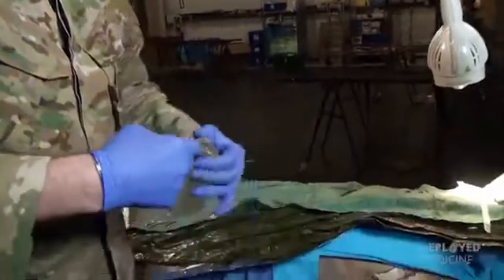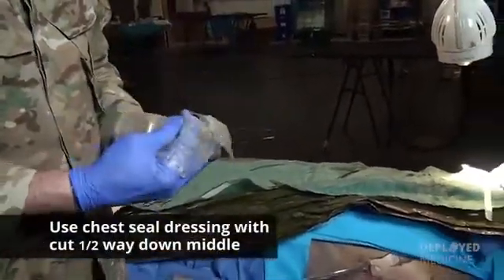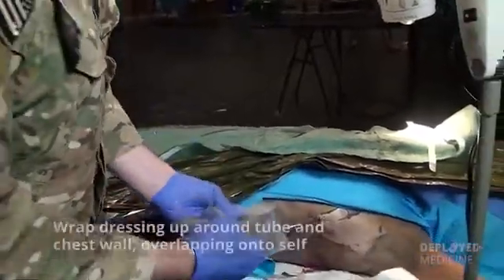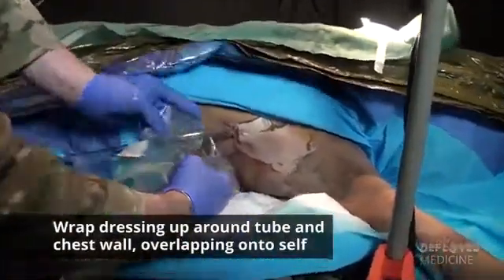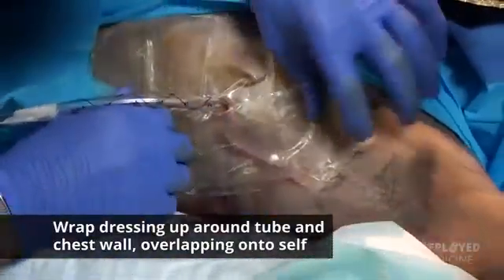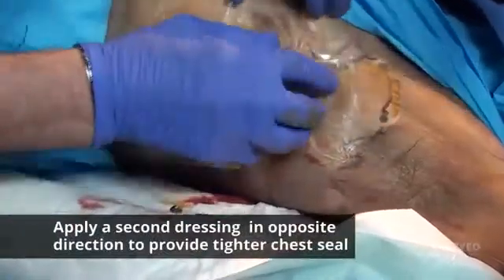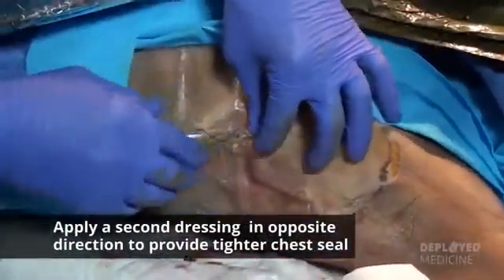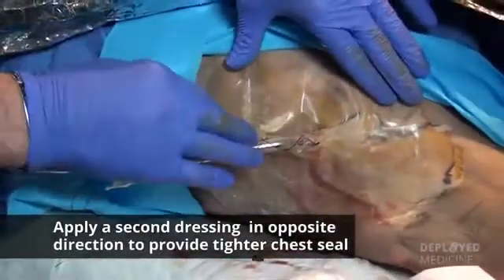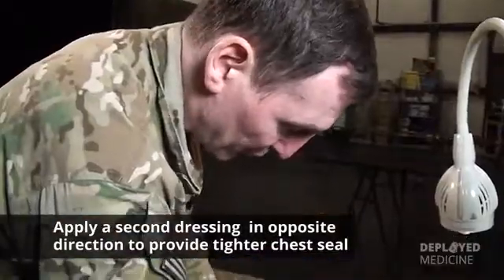In this instance, basically taking a chest seal type dressing, cutting it down the middle about halfway, and we're going to simply wrap it up and around the chest wall, kind of overlap it over the other one. Ideally, you'd have a similar second dressing where you could come over it in this direction, ensuring that you have a much tighter chest seal on your chest tube.